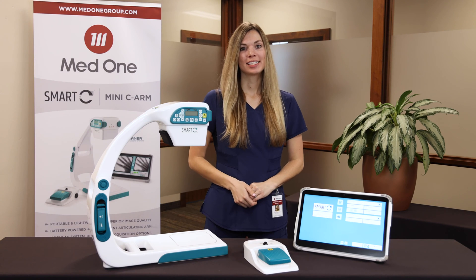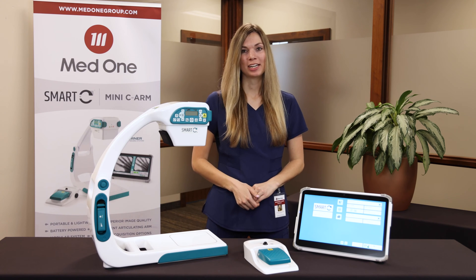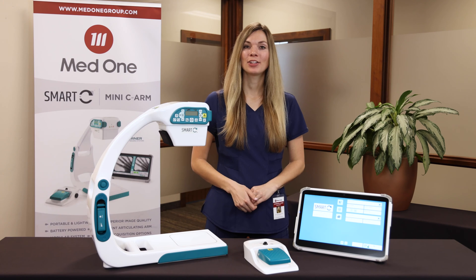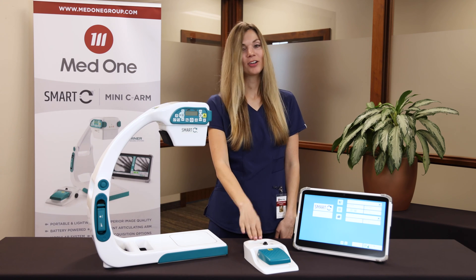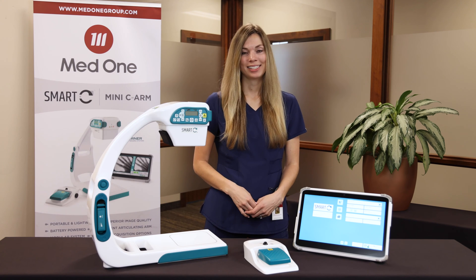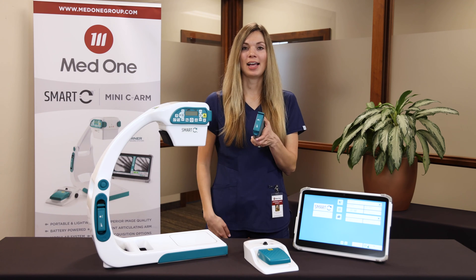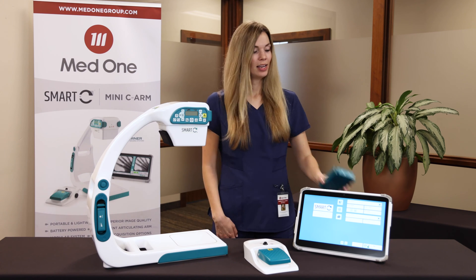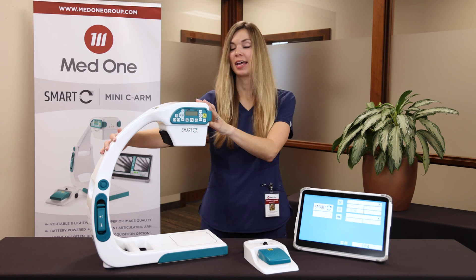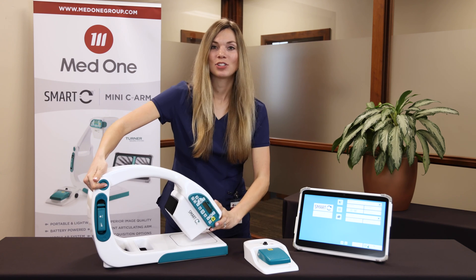First, we're going to go over the different components of the Smart-C system. The Smart-C is a modular system and can be configured for your needs. The basic package includes the Smart-C mini-C arm, a foot pedal, and the tablet. All three components communicate wirelessly and are battery-operated. The Smart-C system comes with two batteries that last eight hours apiece. The Smart-C weighs just 16 pounds, is made of carbon fiber, and the frame is completely collapsible, which allows for easy storage and transportation.